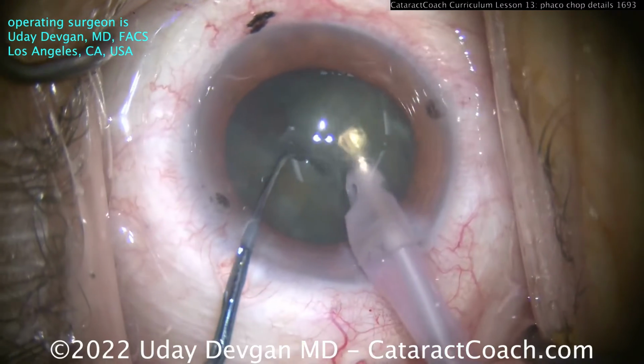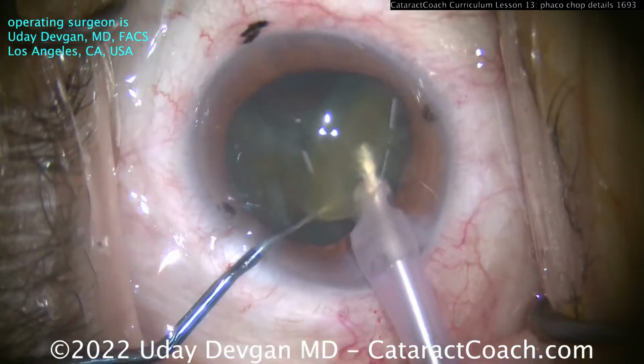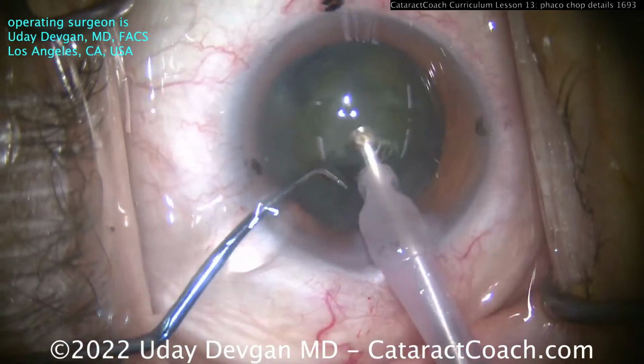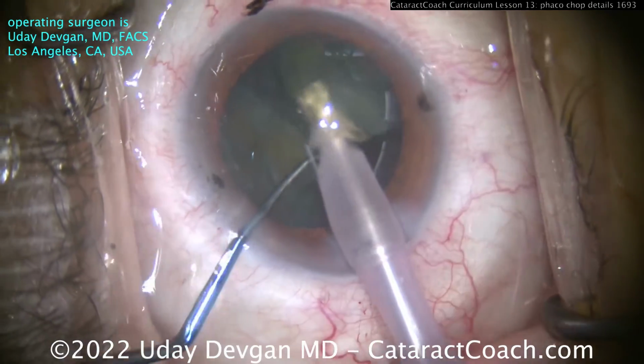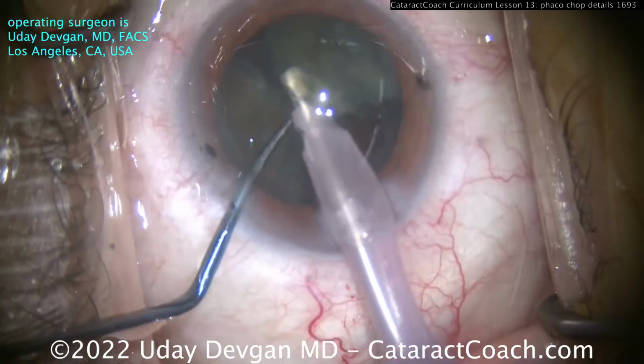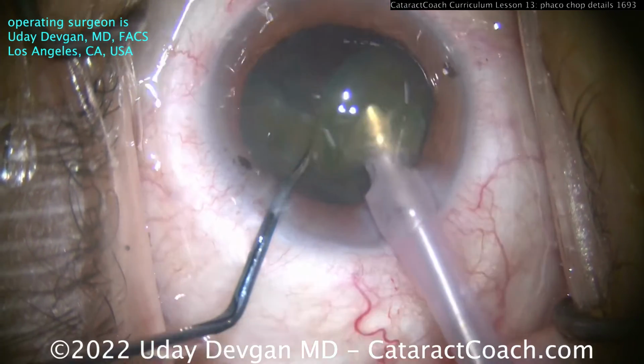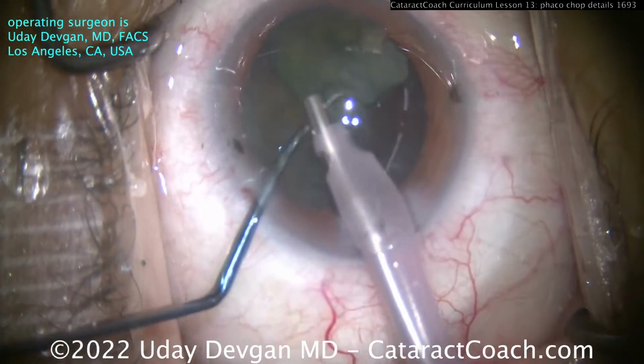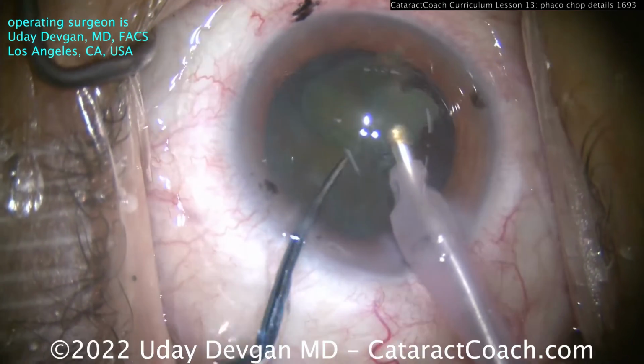And now the chopper's holding the one heminucleus out of the way to create more of a gap, as the phaco probe in the vacuum level brings up the second piece. So one nuclear half is in the bag still. That's on the left side of your screen. And the one that the phaco probe is attacking now is kind of at the iris plane. And you can see you don't have to do much more chopping.